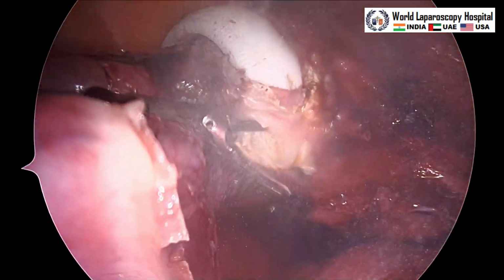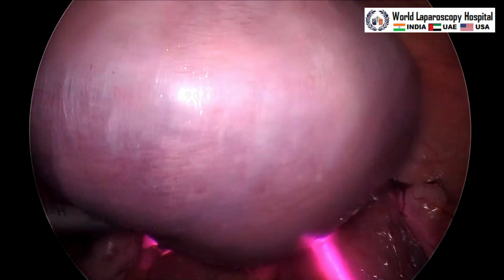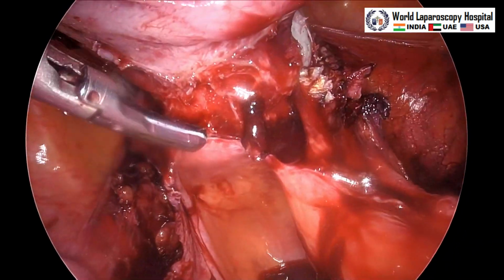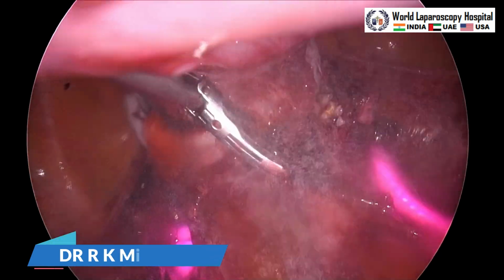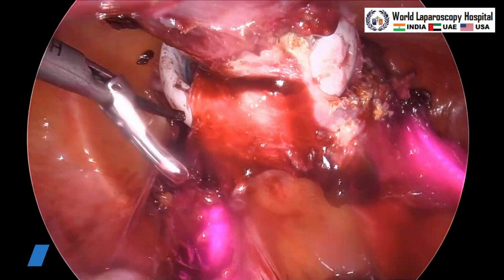And now this is posterior colpotomy started. This is right lateral colpotomy. And this is posterior colpotomy.